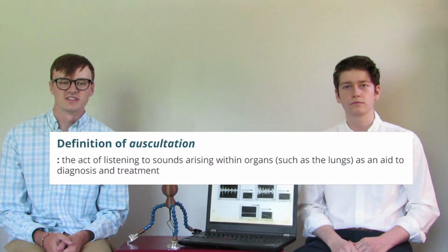A paper that was published in the Indian Journal of Anesthesia cites that 5-point auscultation is the best indicator of ETT placement. However, a device like this doesn't currently exist. To address these problems and provide a superior alternative to the current primary use of end tidal carbon dioxide partial pressure monitors in confirming correct ETT placement, we have designed the first ever real-time digital Tri-Auscultation device for use in neonatal intubation. Let's take a look at it.